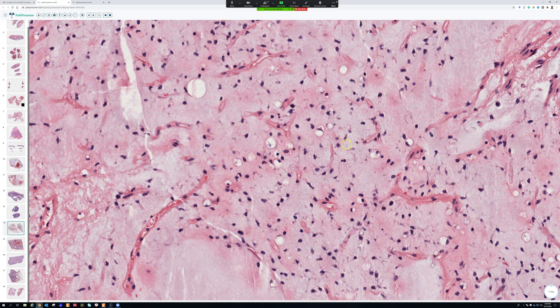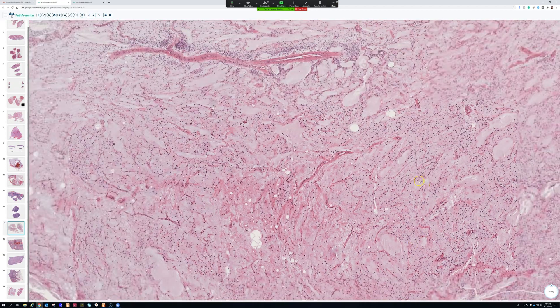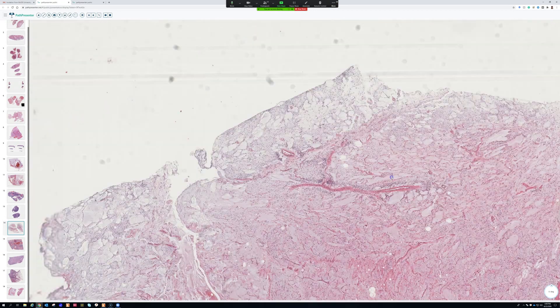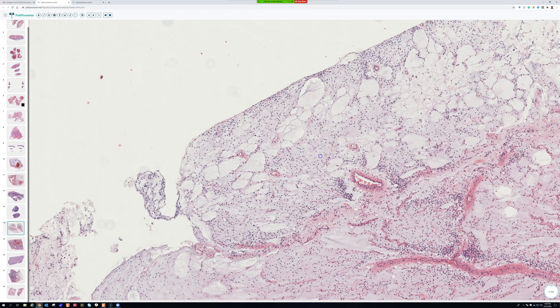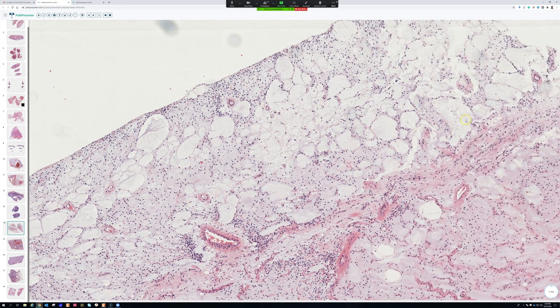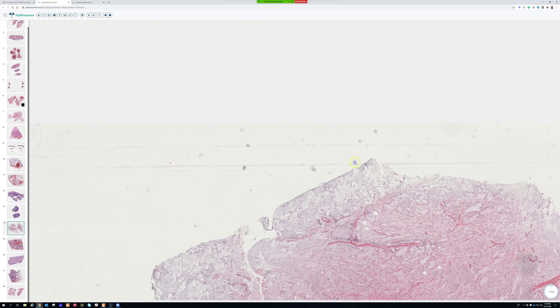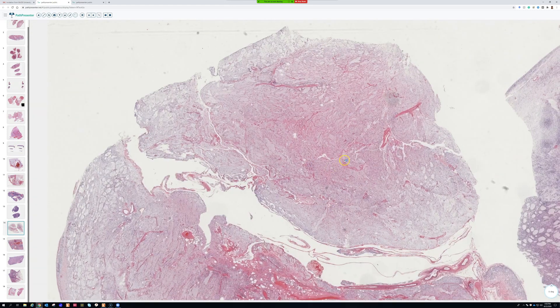Here's an example of signet ring lipoblasts. Also note these pools of myxoid material — this happens in some cases of myxoid liposarcoma and has been likened to the pattern of severe pulmonary edema: big dilated spaces filled with fluid. This pulmonary edema-like pattern is a useful clue that comes up in some cases of myxoid liposarcoma.